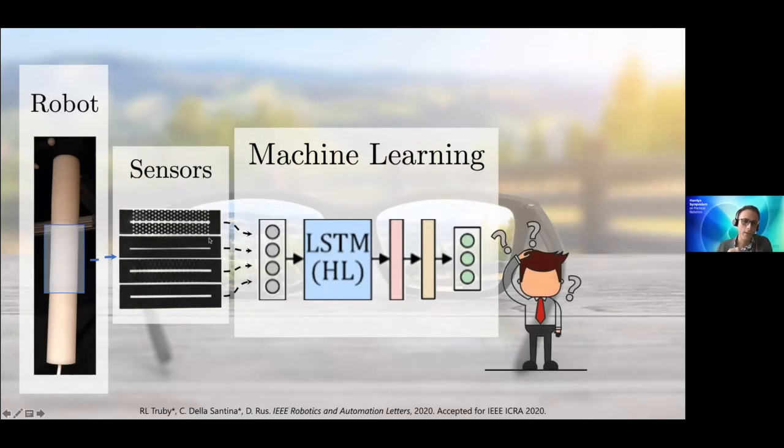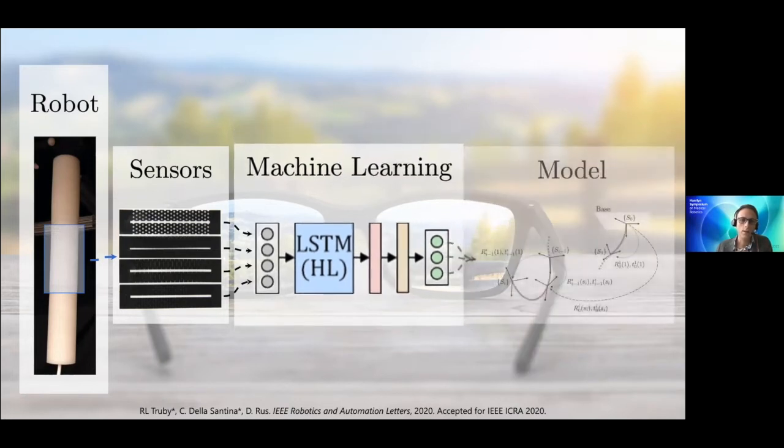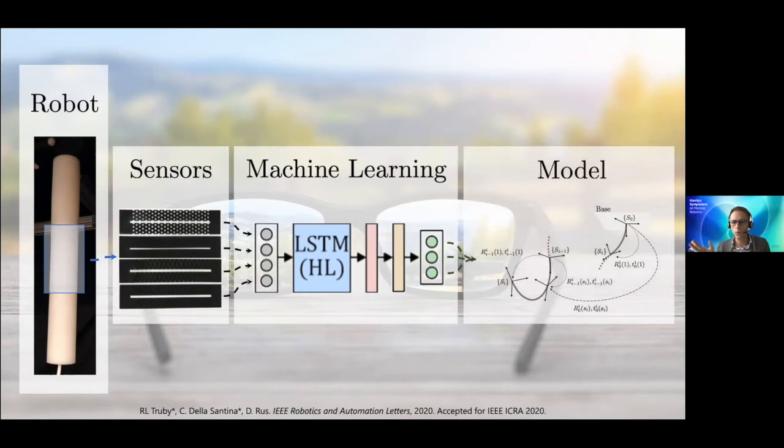because it's clear what you have as input, the output of these strain sensors, but what about the output? The robot itself is infinite dimensional, right? What you could put as output is the configuration of some point along the robot, but this would work just to predict the configuration of that point and not of the whole robot. So what you can do instead is to use models, here kinematic models, and we use a particularly stable one that we proposed, but that is really a detail, to generate, in a sense, a low dimensional description of the robot, a kind of model-based latent space for our LSTM to learn into.